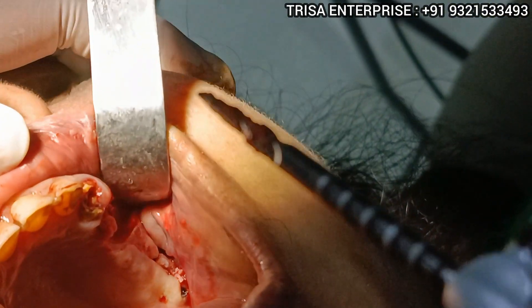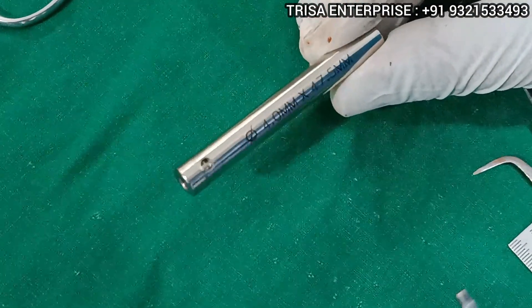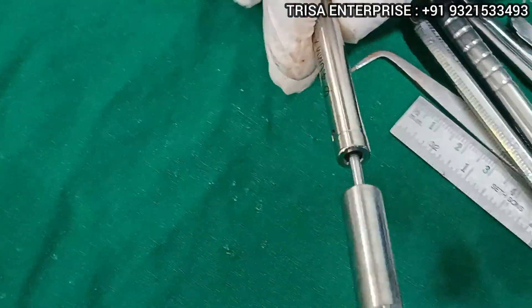I will take a 47.5 two-piece zygomatic implant from the R-line series. You can see here: 4.0 x 47.5 is the zygomatic implant.